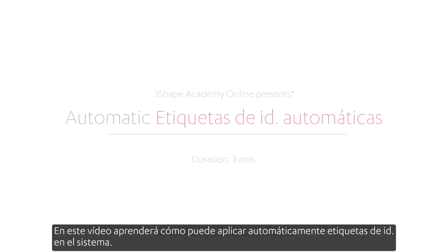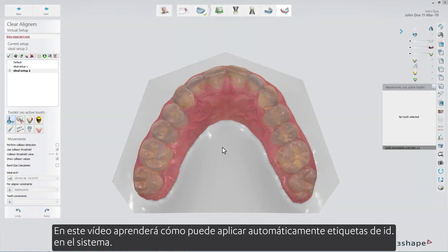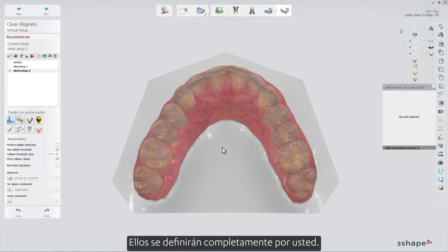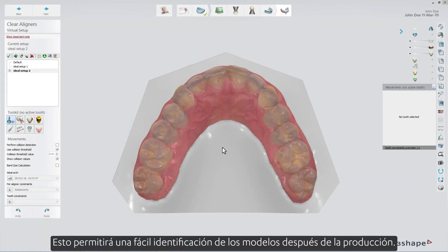In this video you will learn how you can automatically apply ID tags in the system. They will be fully defined by you. This will allow easy identification of the models after production.